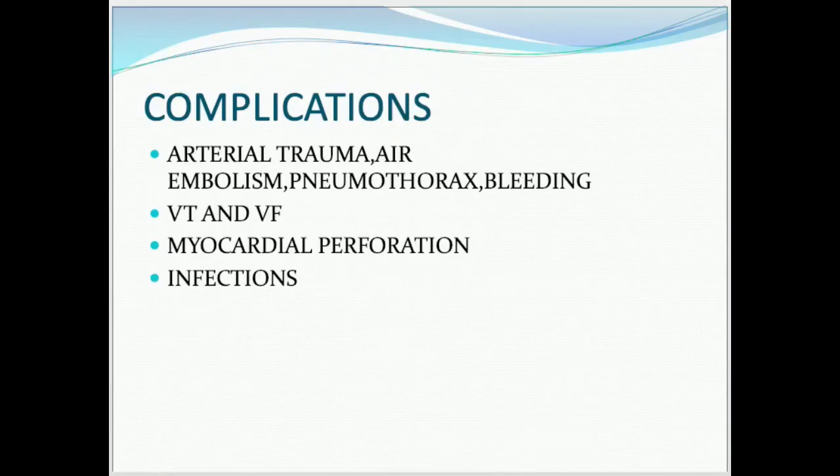The major complications of transvenous temporary pacing are arterial trauma, air embolism, pneumothorax, bleeding, ventricular tachycardia and ventricular fibrillation in case of inappropriate T-wave sensing or T-wave pacing, myocardial perforation, and infection for long-term temporary pacing insertion.